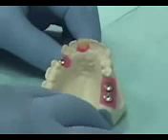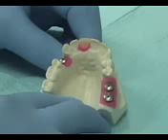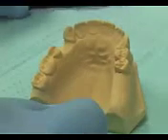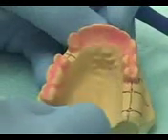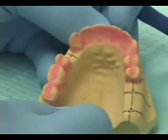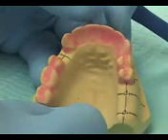For today's demonstration, we have our hypothetical patient and we have used our surgical guides to physically place the implants. In order to get to the place we are now, we remember that originally our patient had no implants in place and we had a model of our patient. On our model, we determined the physical location of the implants and marked them, and then we blocked the model out so that we could make our x-ray guides followed by our surgical guides. So here's an example of a blocked out model for our patient.